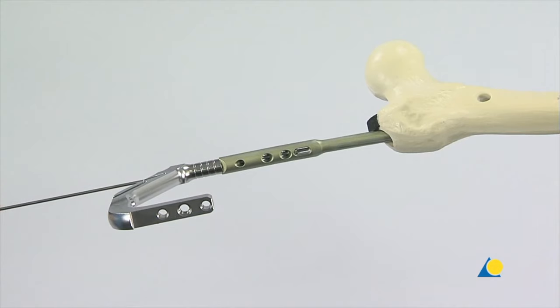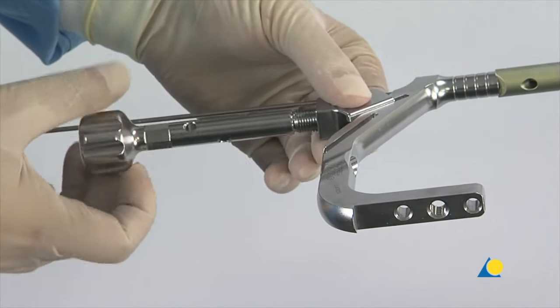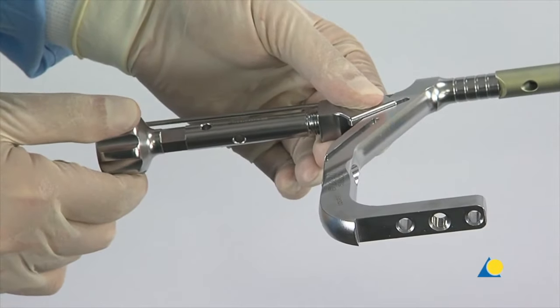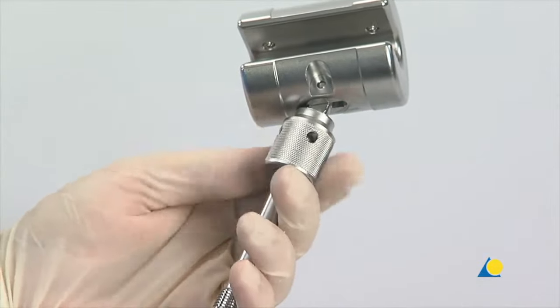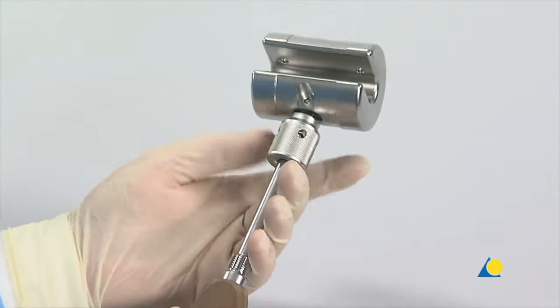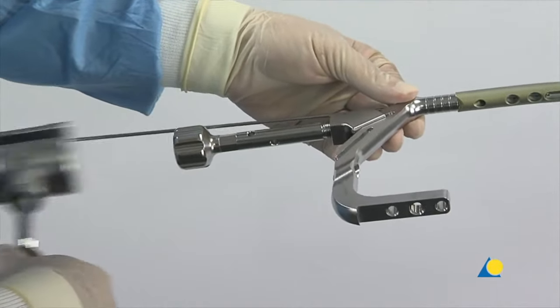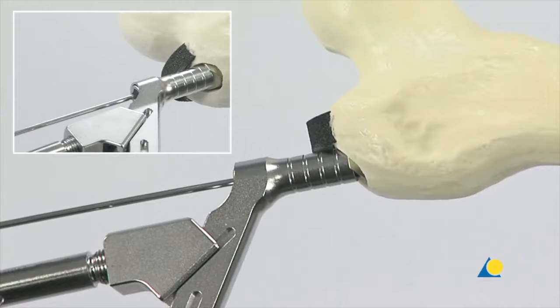The passage of the nail across the fracture is controlled in both planes to avoid malalignment. With hard bone, it may be necessary to advance the nail with gentle hammer blows; however, the insertion handle should not be struck directly. Instead, the connector is used. The connector is slid into the medial grooves on the insertion handle and secured in place. The slot nearest to the nail should be used so that the driving head lies parallel to the nail. The head of the combined hammer is locked in place by tightening the nut onto the threads below the hammerhead. The connector is struck with gentle hammer blows. The nail is inserted until it is level with or just below the femoral opening, and the final position of the nail is confirmed in the AP and lateral views.